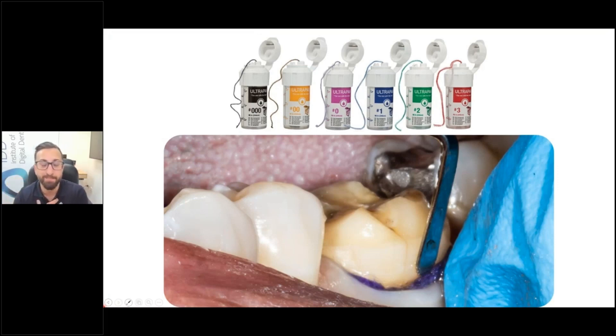When I first started placing retraction cord in my career, I wasn't too confident, so I would use the smallest cord available because that was easy to pack. But the thing is, that doesn't really displace the tissue much. So these days, oftentimes I'm going straight to a number two or a number one, especially for molars.